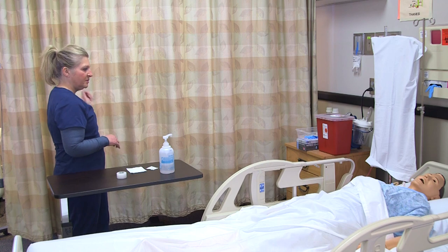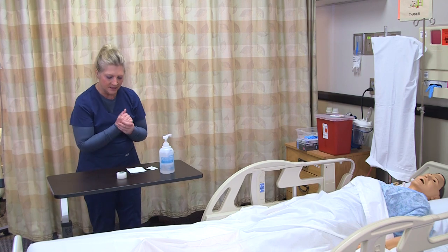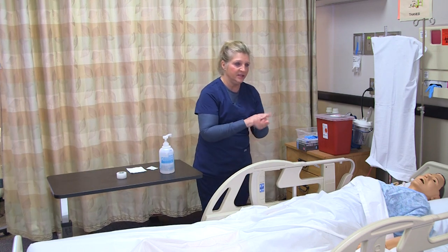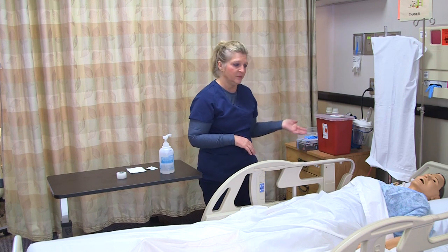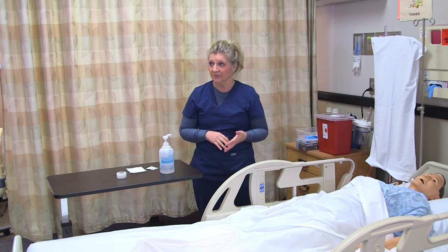When I come into the patient's room, I make sure I provide privacy, wash my hands, introduce myself, and identify my patient. I use two identifiers — full name and date of birth — check it with the electronic medical record, and explain to the patient what I'm doing.